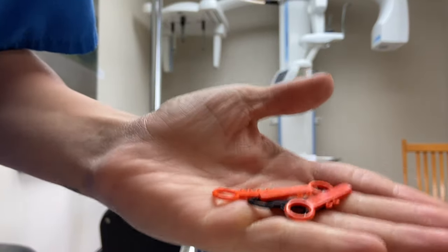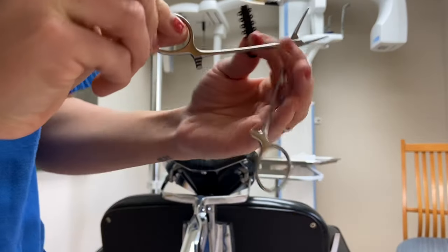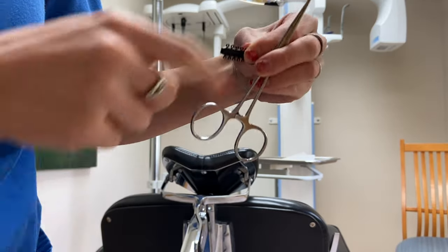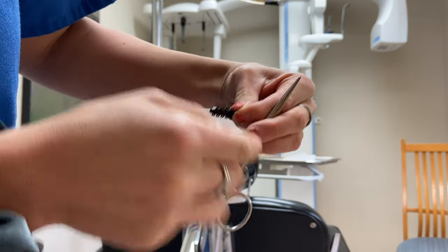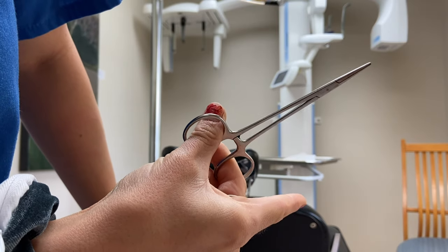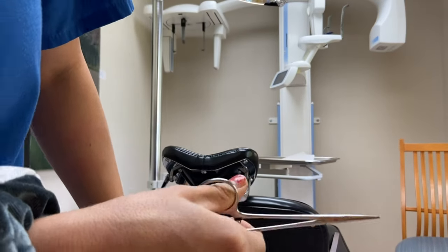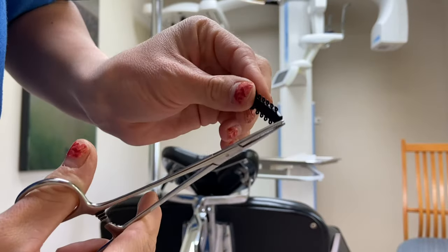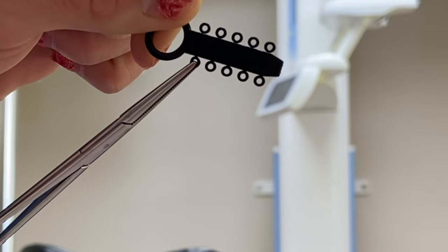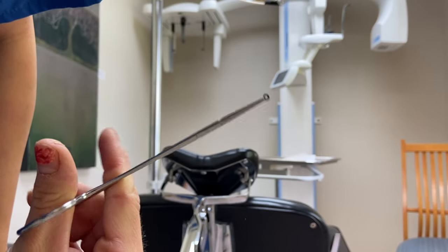I picked black and orange for Halloween, so that's what we're going to do. What we use is a hemostat — it's kind of like scissors, but it's not. They lock like that so you can hold whatever's in there. You release them by clicking and then pushing it in and out, and it unlocks. To lock it, obviously just click it. I'm going to take an elastic to clip it — you don't want to clip it right there because that doesn't give you enough room to work on the bracket. You want to go as far down as possible and pull it off. And there you have it — it's locked on there.